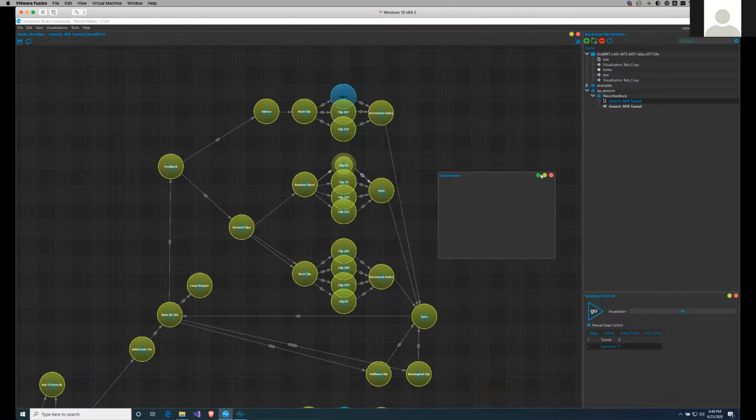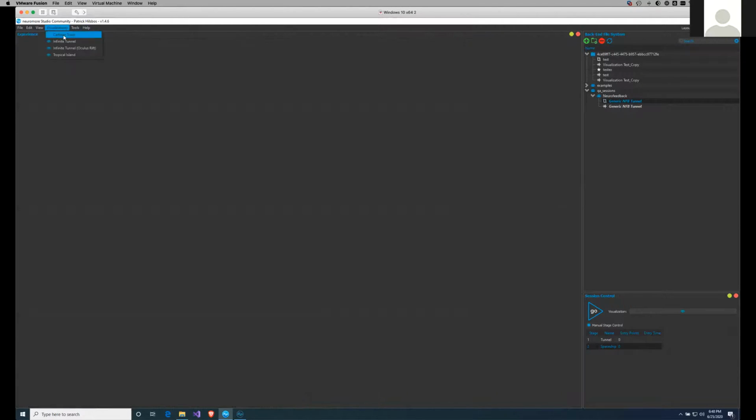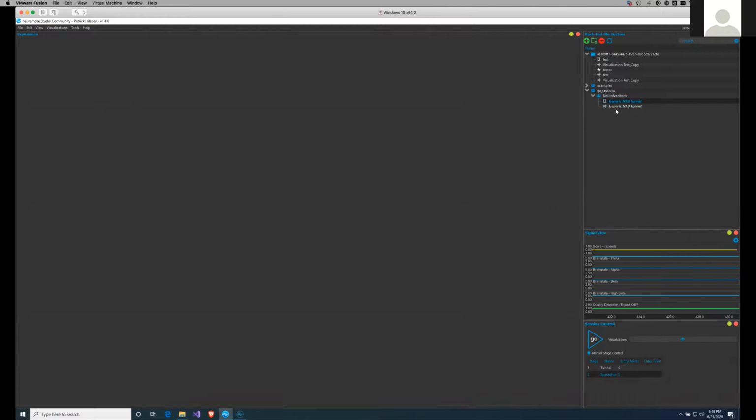Lots of talk. Let's look at it. Let's also put on a little bit more of the end user's head. Let's do it somehow in between, let's add a little signal view to it.